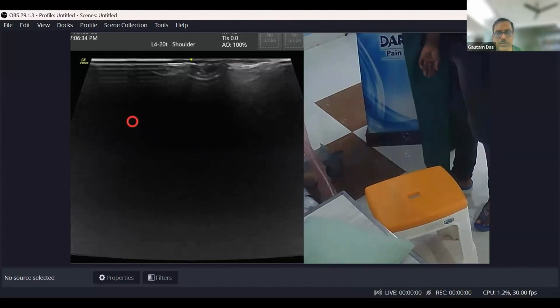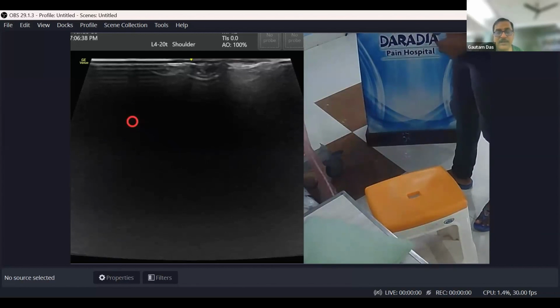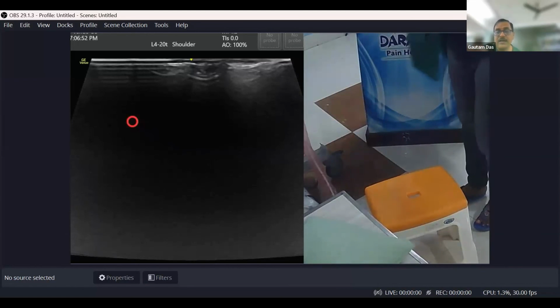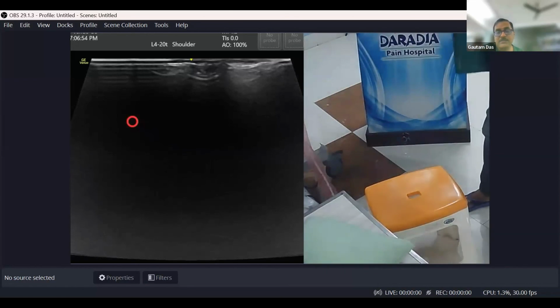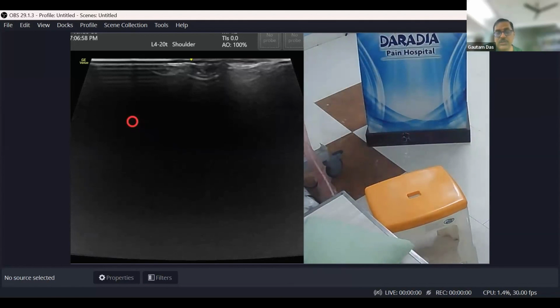There are two approaches. You can come from anteriorly through the rotator cuff interval on the side of the bicipital tendon, or you can come from posteriorly, just lateral to the labrum, piercing the capsule, and inject there. Both are accepted techniques. You inject a large volume, which distends the joint, and it is basically equivalent to manipulation under general anesthesia. So that is the technique.